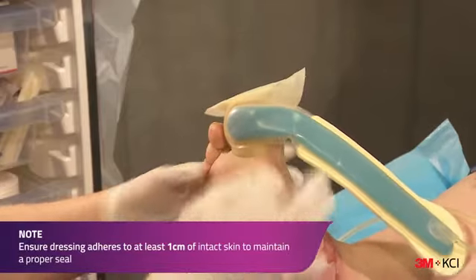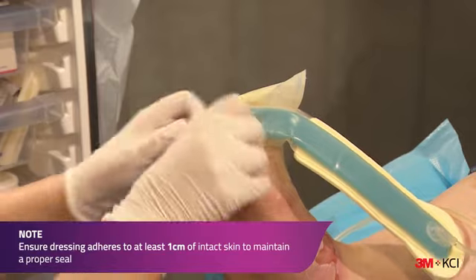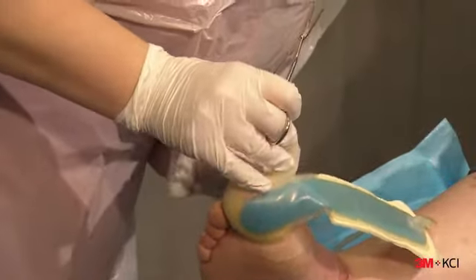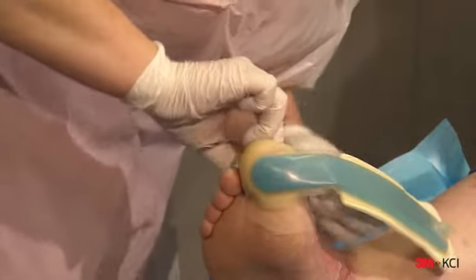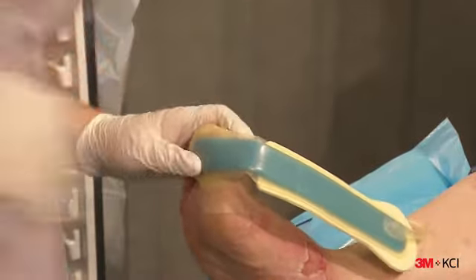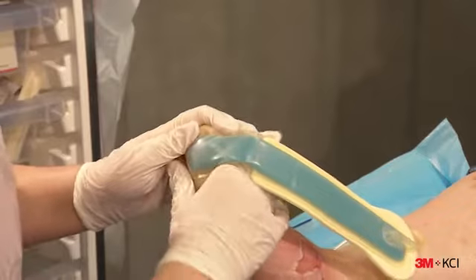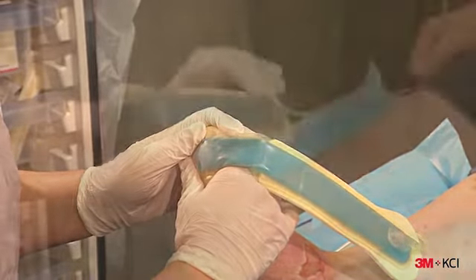Use your hands to smooth out the dressing to ensure an airtight seal to the skin. Ensure that a minimum of one centimetre of intact skin around the wound is adhered to the dressing to maintain a proper seal. Note, it's often helpful to hold your warm hands over the dressing to allow the adhesive to properly adhere to the skin.